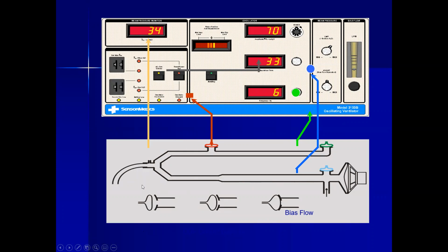I don't know if it helps to look at this mushroom valve in two dimensions, but when there's air in the valve, it can touch the opening and then prevent air from leaving. So right here, when the mushroom valve is touching, it occludes the opening. So no air can get past it. And you change this by changing the settings.